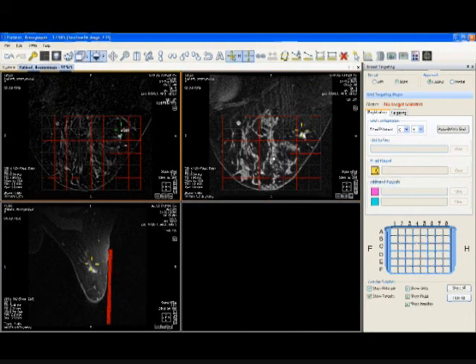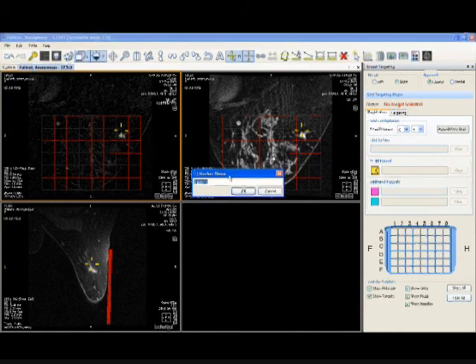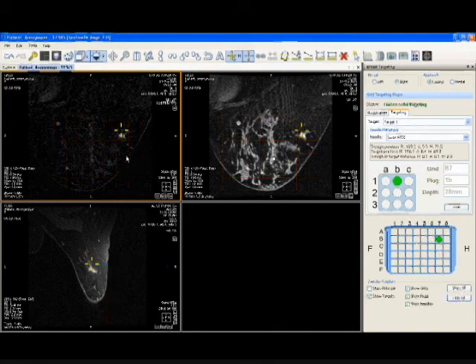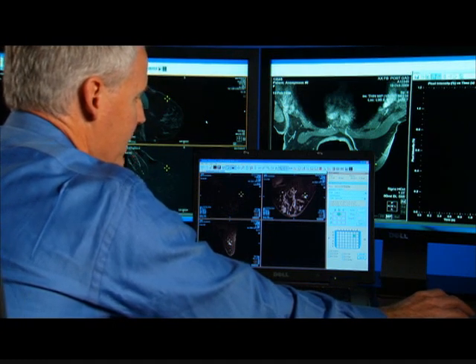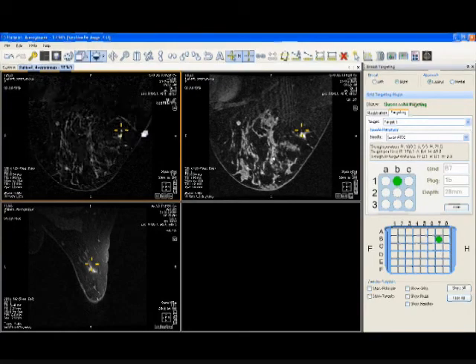So as we targeted our lesion in this area, we simply add a target, and then we're able to see where to place the needle both within the block as well as within the grid system. Having done that, the next step as you insert the trocar is place that. In this case, there was a fair amount of resistance, and so I advanced the trocar slightly greater than the 28 millimeters initially indicated, primarily for fear of tenting of the fibroglandular tissue.